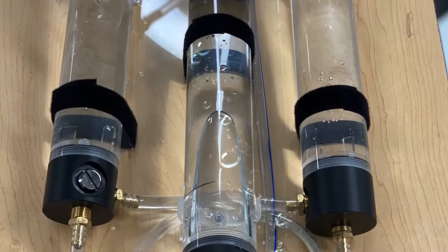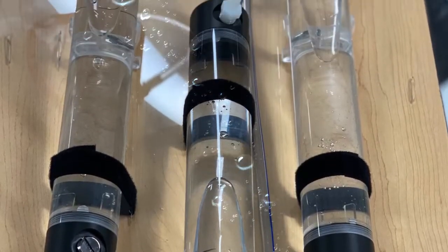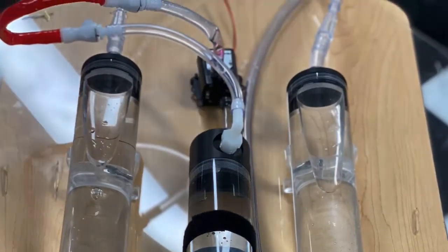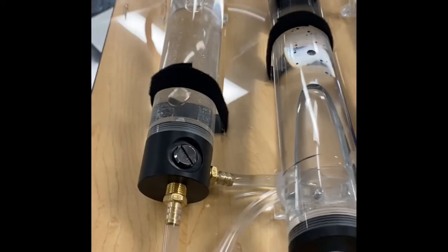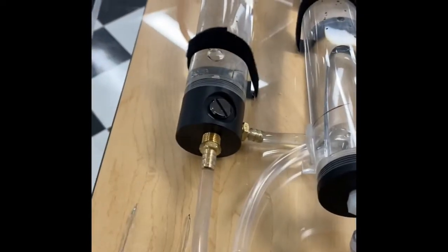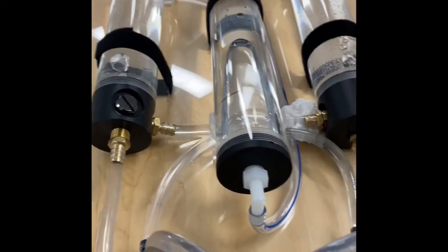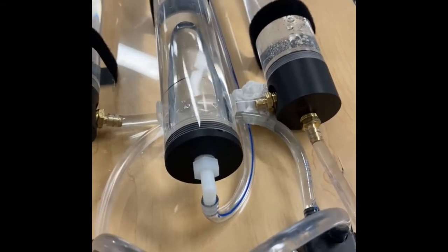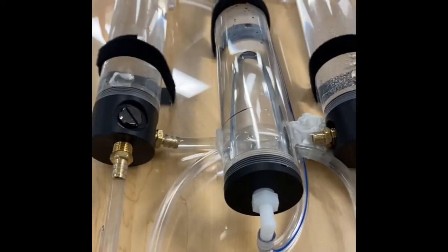Here all the reservoirs are filled, all lines have been primed, and the jugular site's suturable vein has been installed. With the lines primed, it is best to run the circuits to leak test — the paper towel you see is proof. Even after numerous runs, a leak can arise, which you do not want happening during a possible ECMO activation test.